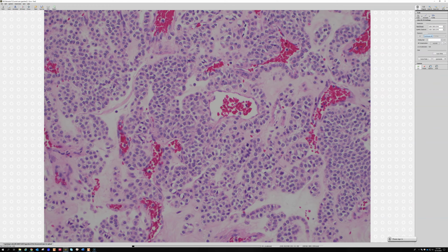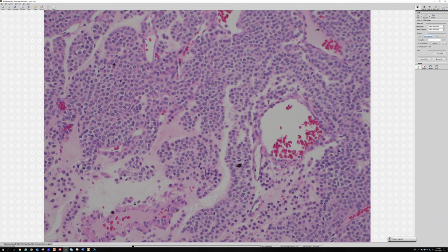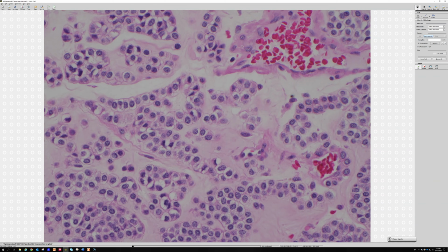The other thing that I've noticed that you can use sometimes, you don't usually need it, is, let's see if we can get it in better focus here. Hold on, let me find a good area. The individual cells, oh there, perfect. Look at these guys. The individual cells are wrapped by a layer of basement membrane. You can very distinctly see the outline of each single individual glomus cell. That's really characteristic of this tumor. So if you do a collagen 4 basement membrane stain, like an immunostain, or even a PAS, it can really light up the wrapping of basement membrane around each cell.